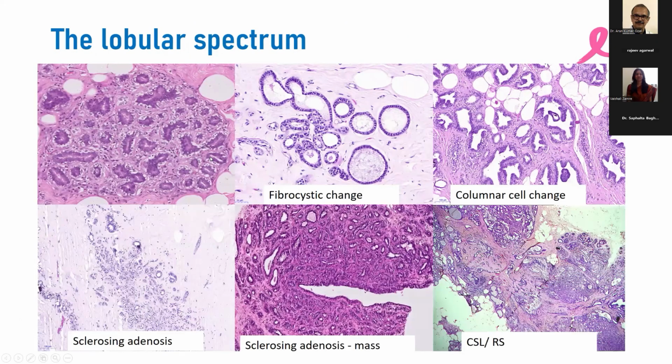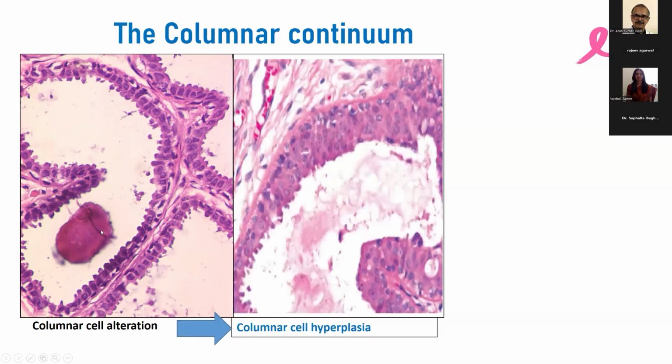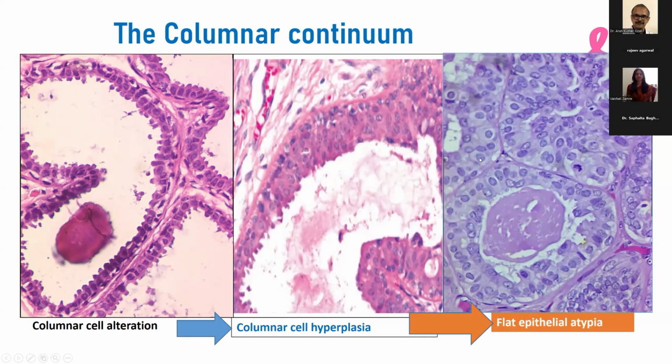If you remember, the breast epithelium is very flattened like this when it atrophies. Here, this is not an atrophy, but it is pre-neoplastic conditioning of cells. So the cells become, instead of flat, apocrine with this snouting. And because there are snouts, they develop calcification, and it is the most common lesion that ever comes up on radiology. Now imagine this particular pathology remains. You get hyperplasia added on this, so you call it columnar cell hyperplasia. And when it remains for a longer time with more mutations and mitosis, we call it flat epithelial atypia or columnar cell atypia. This can be called variably.